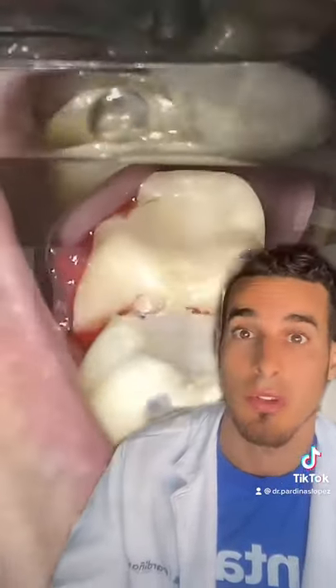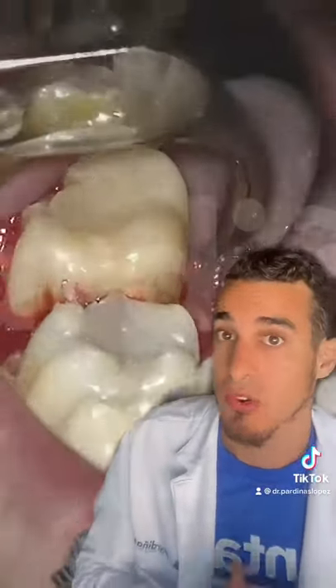It's called like that because of the shape of its head. With these forceps we're gonna make gentle movements back and forward and circumduction until we extract the tooth.